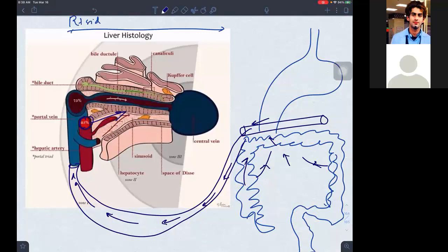That's a beautiful thing. Can you see here that he has built it very much thick? Things are more coming to this liver. So you should remember this concept: one is the portal vein, and another is the hepatic artery. The hepatic artery is bringing oxygenated blood from the heart, and this is from the GIT circulation, isn't it? Easy.